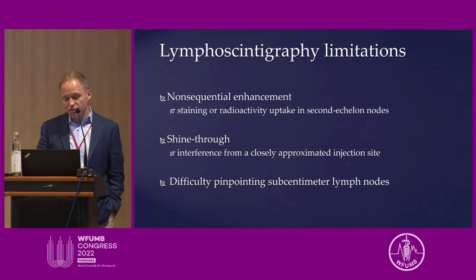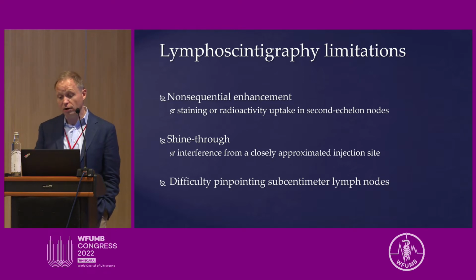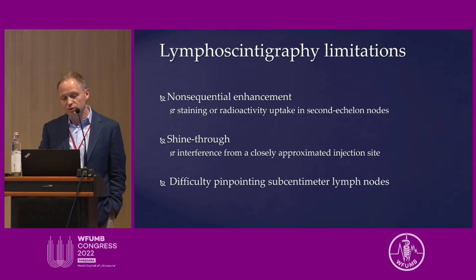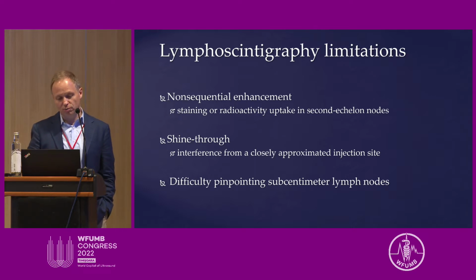There is also shine-through, where we can miss lymph nodes that are very close to the injection site, and we see this quite often in our patients. And then there is also difficulty pinpointing very tiny sub-centimeter lymph nodes, because the resolution of the radioactive technique is extremely poor.